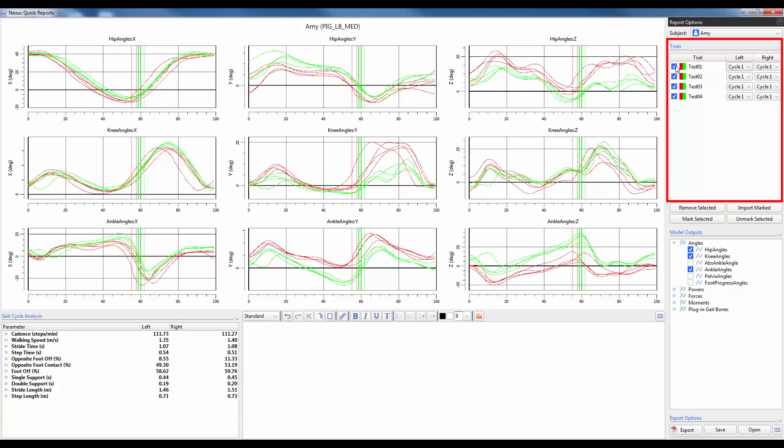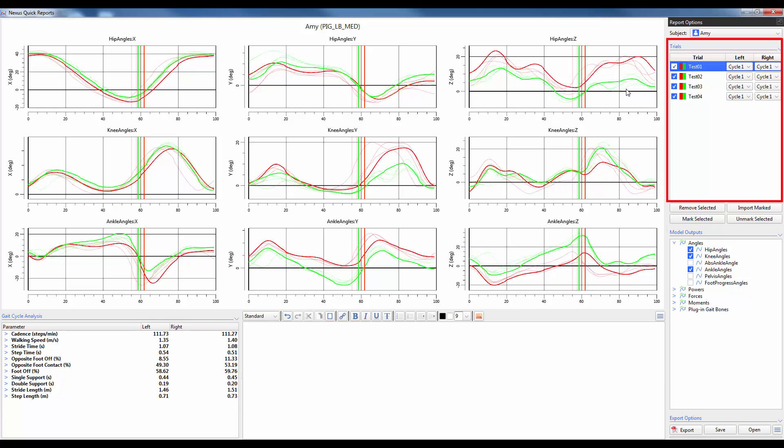If you want to identify a trial before unchecking it you can go ahead and highlight it and you'll see that the model outputs have turned bold. This will help you identify outliers a bit more easily.